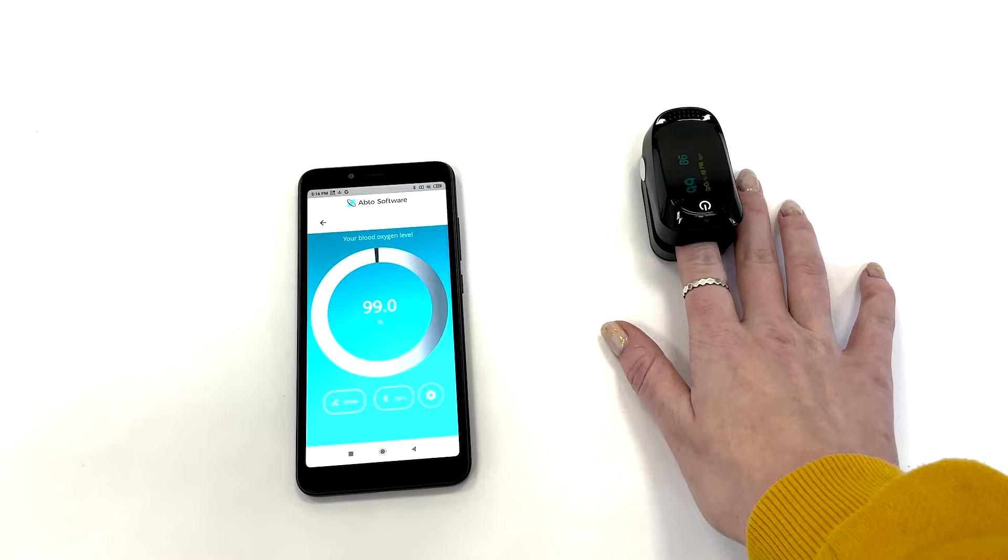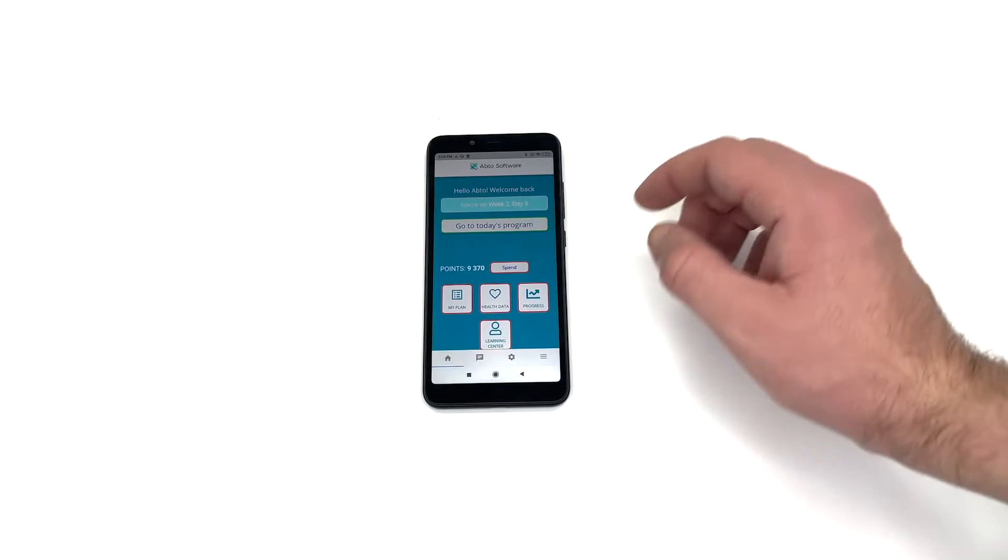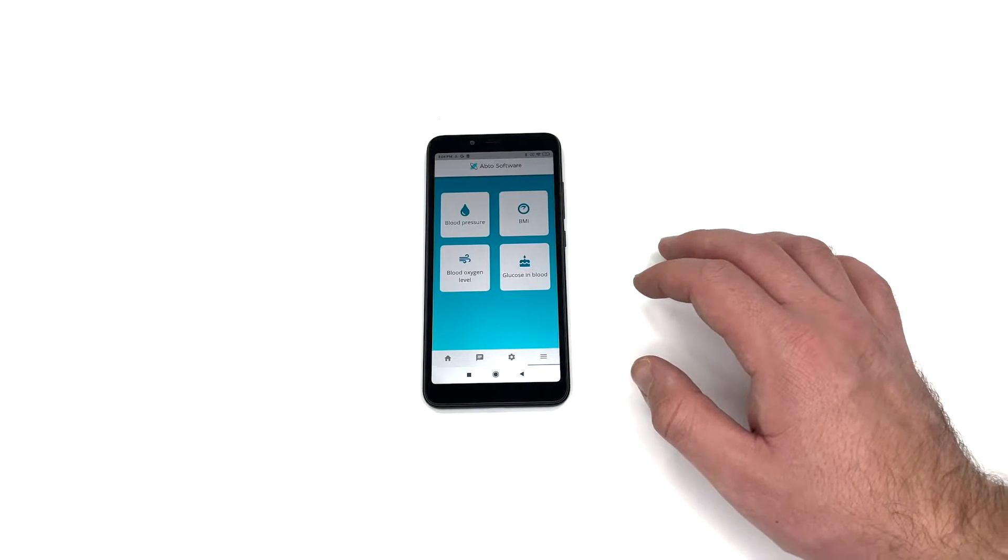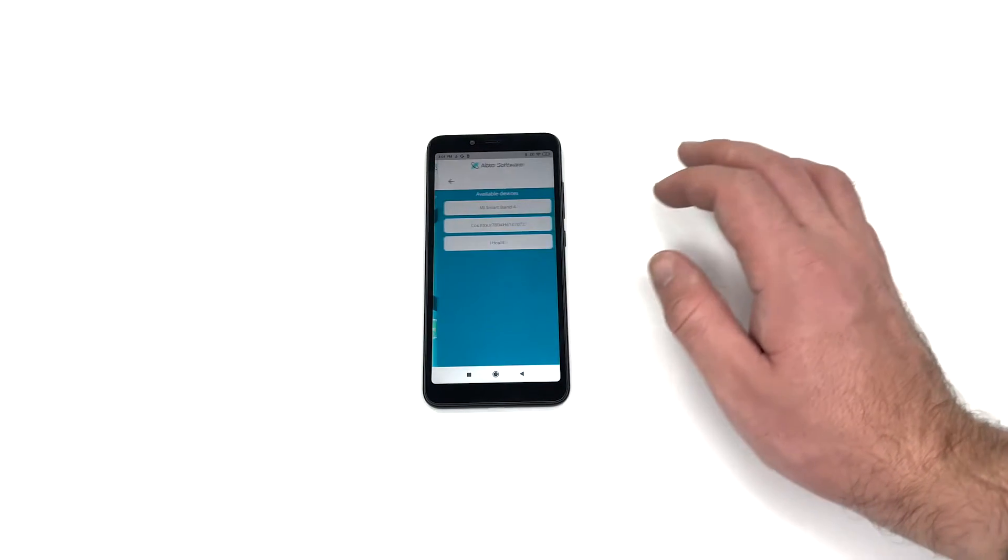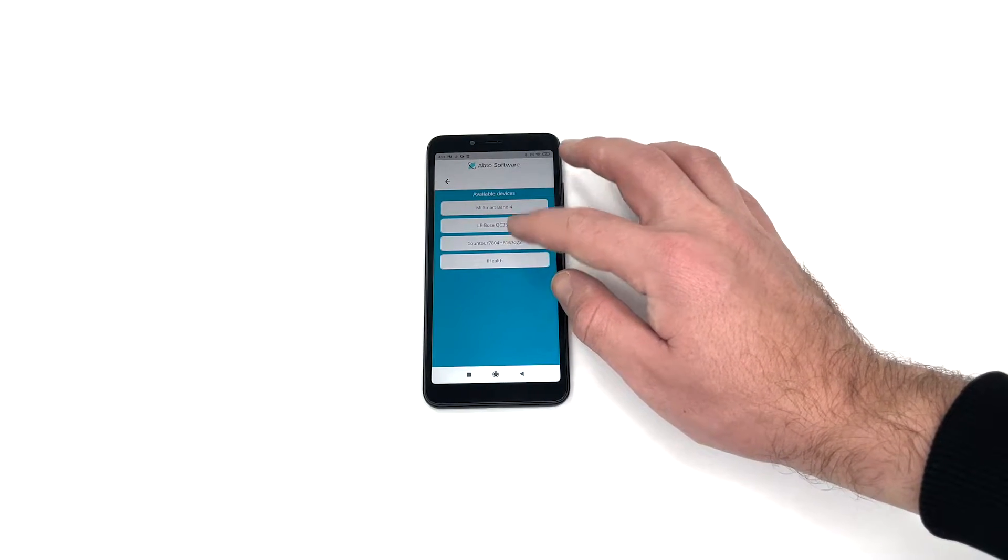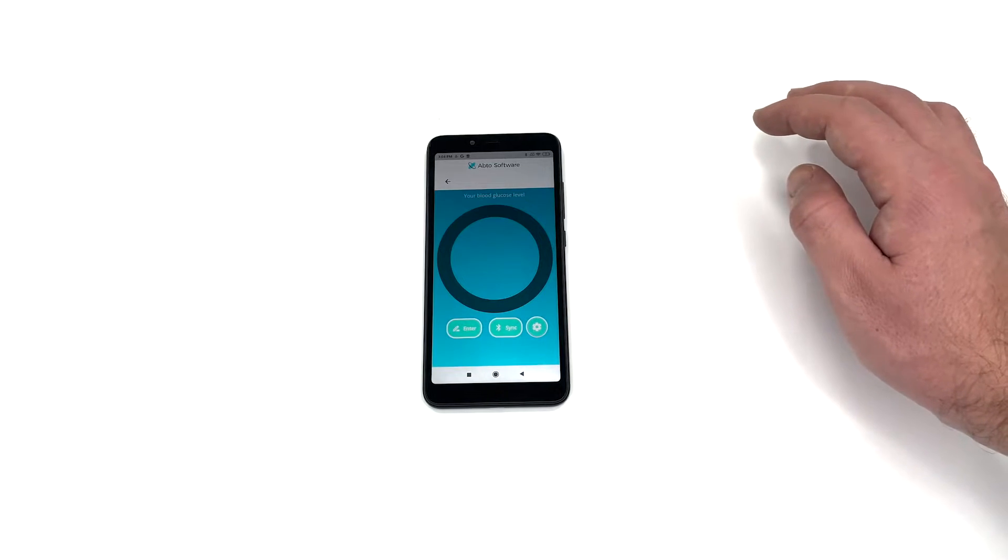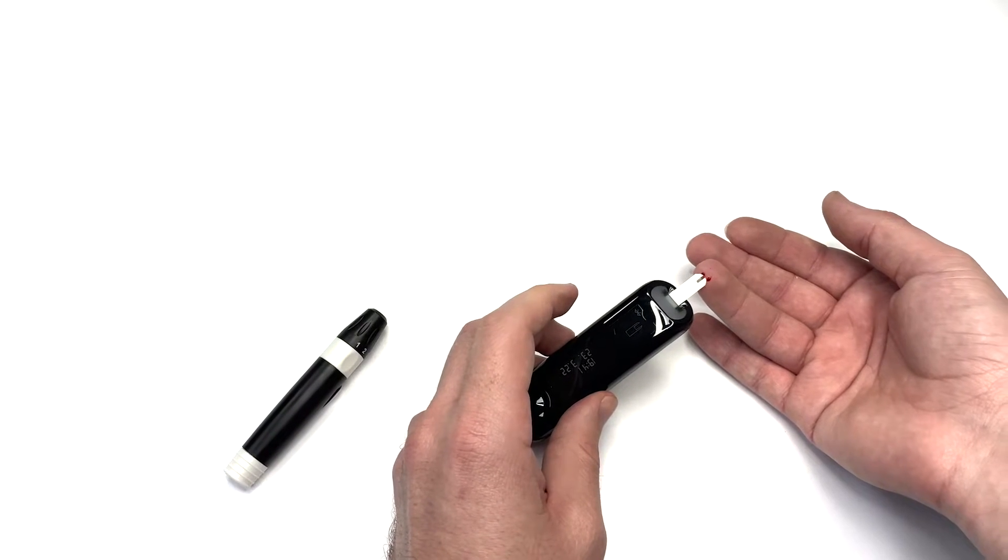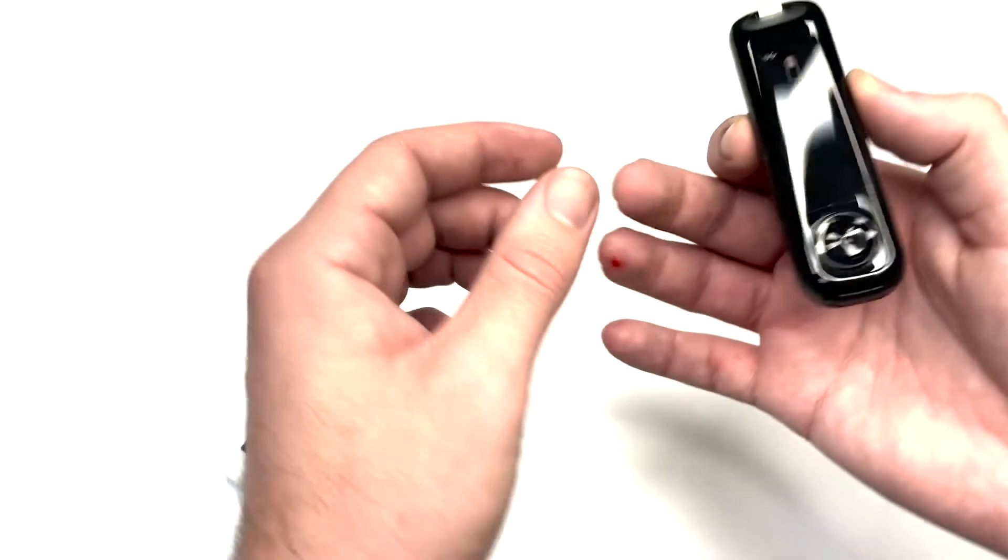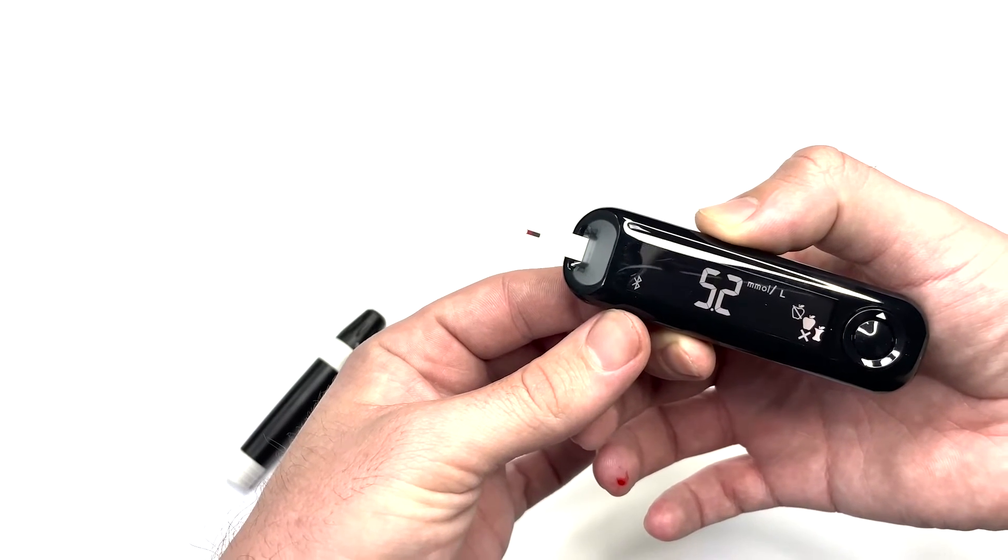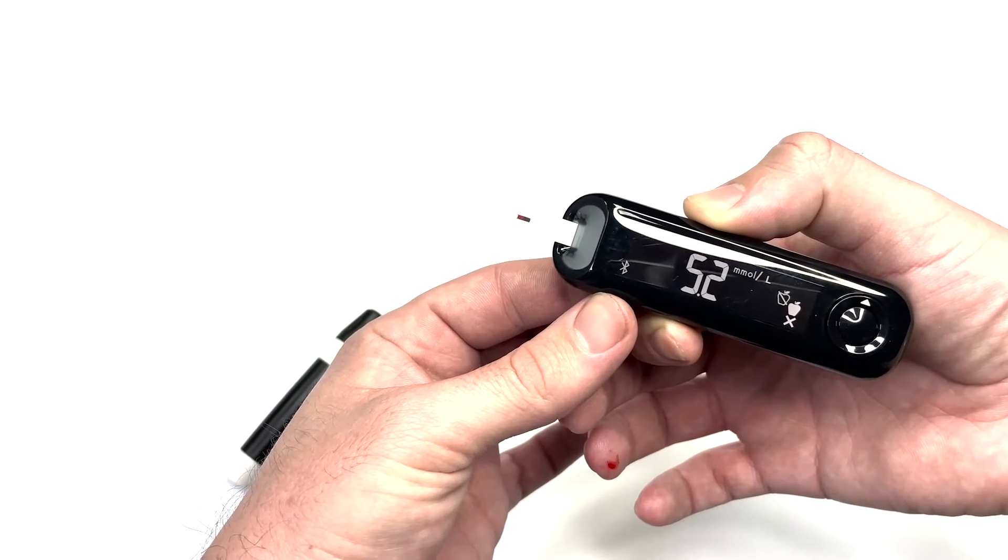You can also measure the blood sugar level by connecting a blood glucose meter via Bluetooth. Choose the desired category, synchronize the application with nearby devices, choose your medical device, and measure the blood sugar level. Again, the indicator will be displayed automatically.